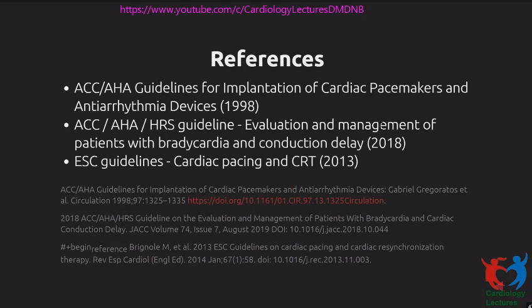And like I said, if patients have paroxysmal AF, if you put them on VVI, you're more likely to push them into permanent AF. So it's always better to pace them with atrial-based pacing, which means either give them AAI or DDD. And I think atrial pacing might have some amount of antiarrhythmic effect in that it delays their progression to permanent AF. So the answer is sinus node dysfunction with paroxysmal AF, definitely prefer DDD. But if it is permanent AF and they need pacing, then VVIR.